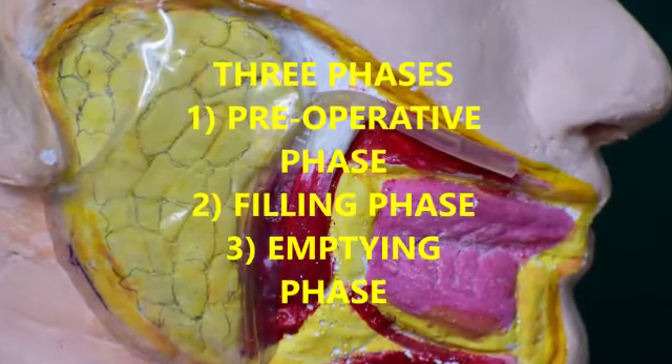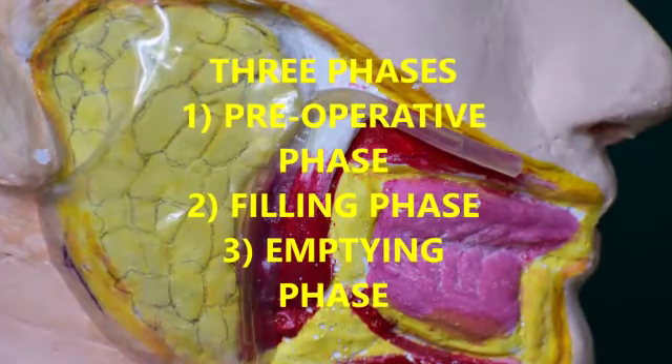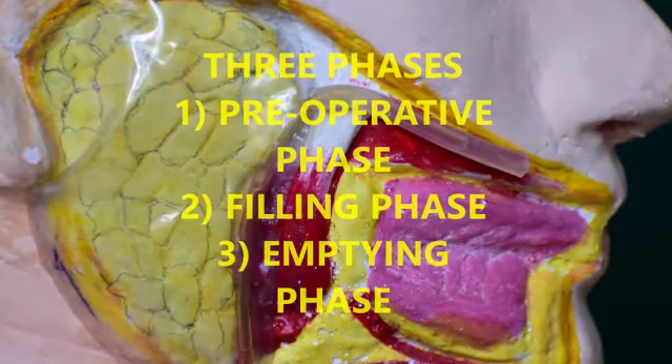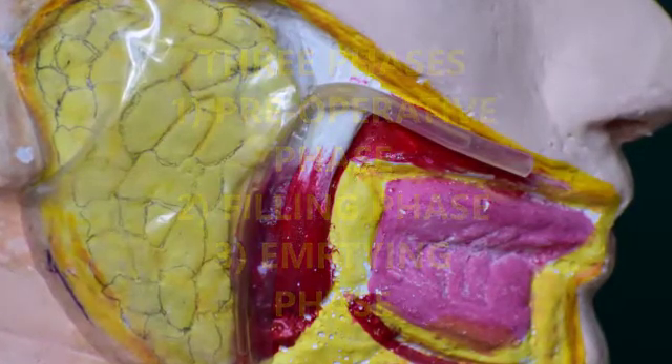Now let's take a look at the second phase called the filling phase. The relevant duct orifice needs to be found. For the parotid gland, the orifice is located at the base of the papilla in the buccal mucosa, adjacent to the first or the second molar. The calibre of the duct is 1–2 mm wide.